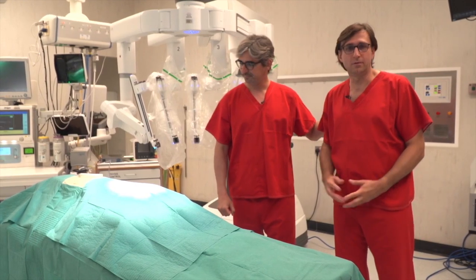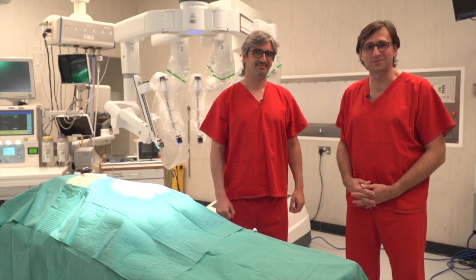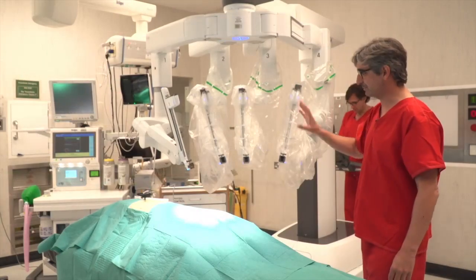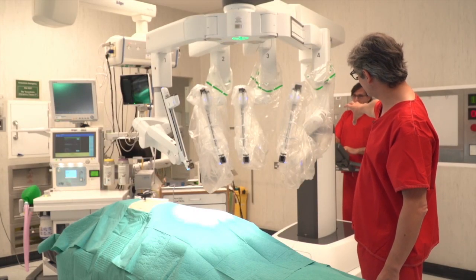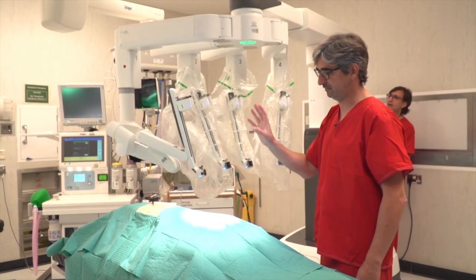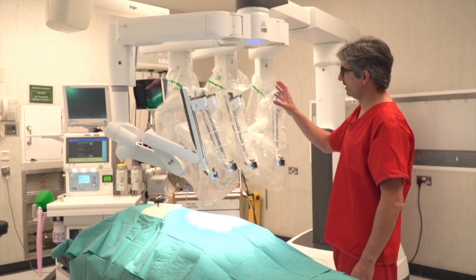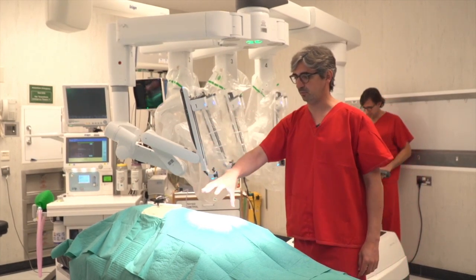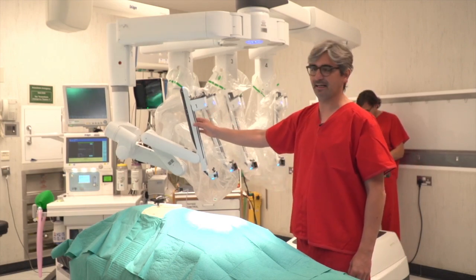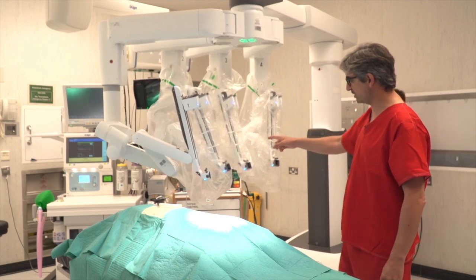Mugur, do you want to say something? — I'm ready to position the robotic arms. — Fantastic. Let's drive. It doesn't matter if the robot is on the left or on the right. For this right side case, because this is right upper, behind the right thorax, we need to cancel arm one. Let's go. It is very important now to move the robot with the laser. There is a laser here, you will see.